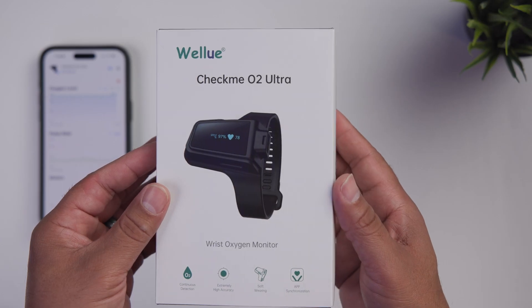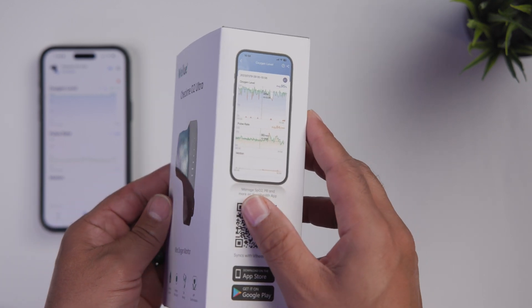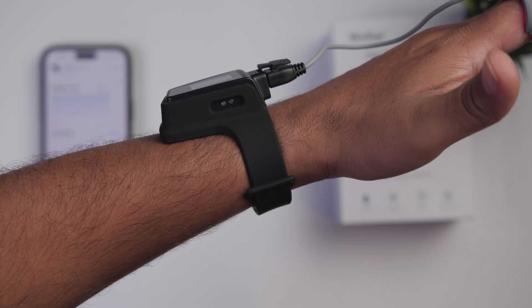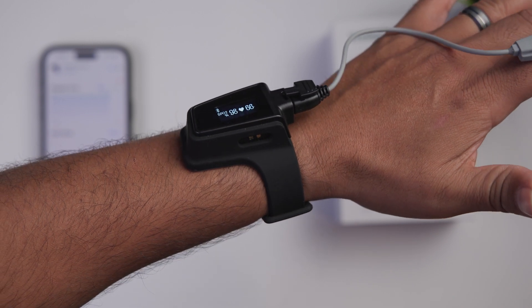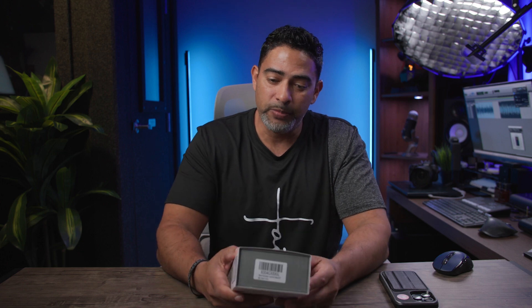Checking your oxygen level and your heart rate is a great way to get a snapshot of your current health. Today we are taking a look at the WellU CheckMe O2 Ultra wrist oxygen monitor. If you need to check those vitals instead of going to a specialist, pick up one of these and take care of it right in the comfort of your own home.